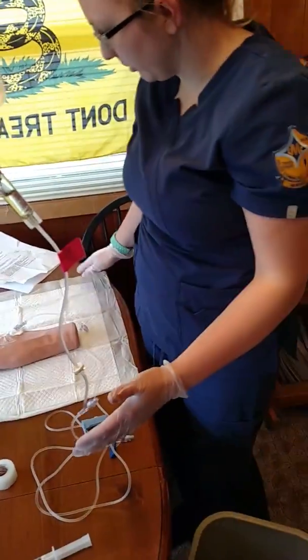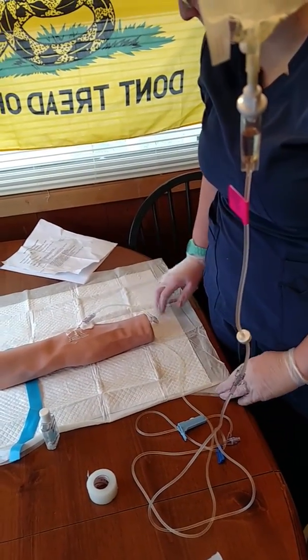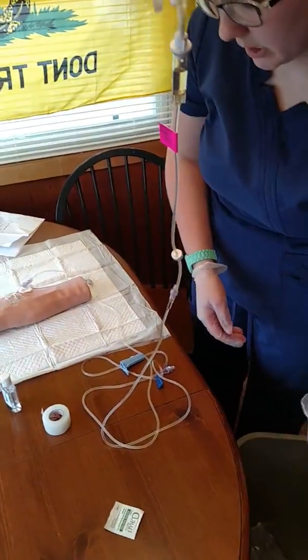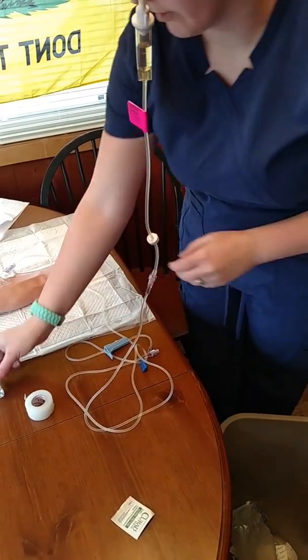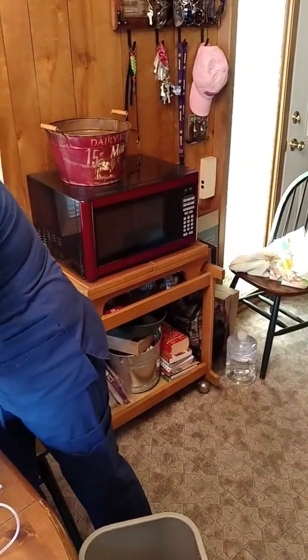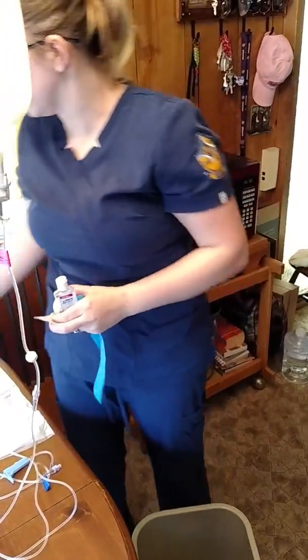We're all set. Are you doing okay, Ivy? Yep. Great. Okay, I'm going to lower your bed. I'm going to give you your call light. Is there anything else I can get for you right now? No, thank you. Okay, so I'm just going to clean up my mess here. And I'll get out of your hair. Wash my hands as I leave. I'm going to go document how the patient took it, what arm I put it in, what solution we've got going, and how fast. Alright, we'll be back a little later to start those antibiotics. Thank you.